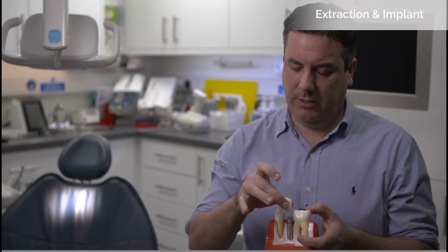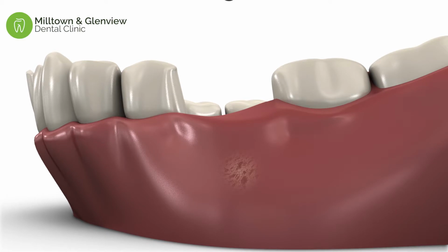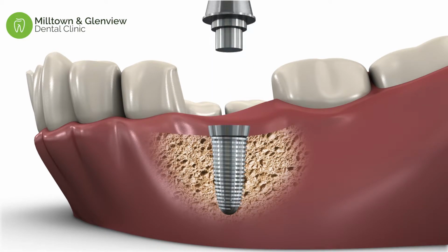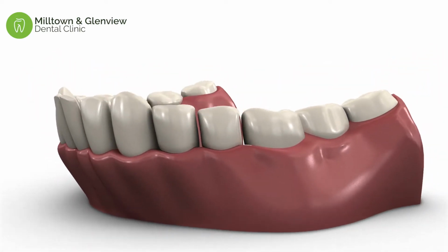Effectively, what we do is we place the implant, which is a titanium fixture, into the bone. We then place an abutment on top of the implant, and then the final restoration, which is the crown, which either cements or screws in place. The implant process comes in 3 parts. The first stage is surgery, the second stage is the restorative phase, and the final stage is the aesthetic crown, or the zirconia crown that we use to restore it.